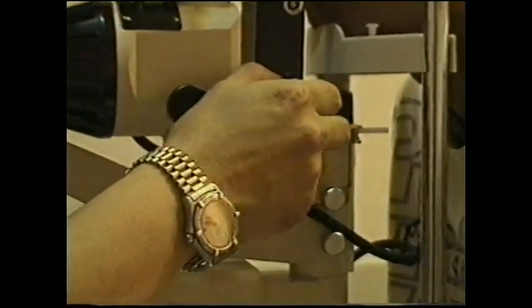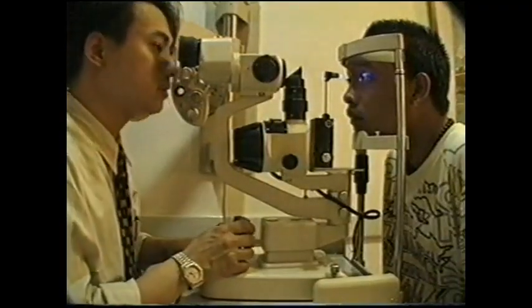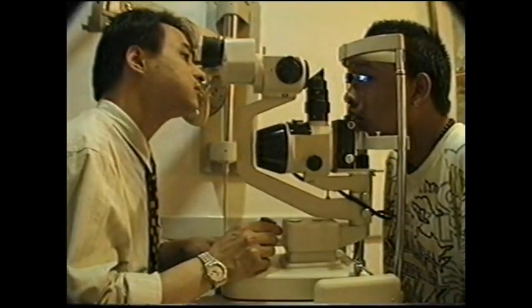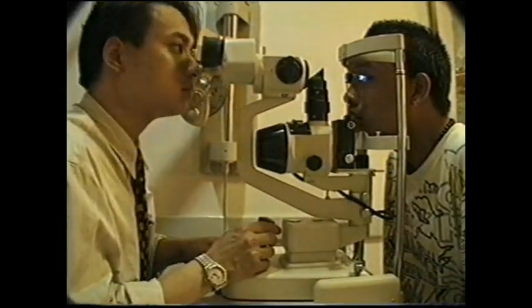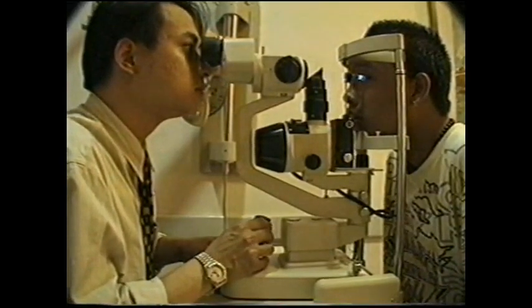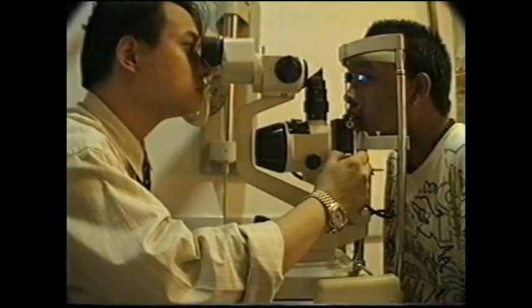Raise and lower the slit lamp biomicroscope with the control handle until the semicircles are equal in size. The semicircles can be viewed monocularly through only one of the slit lamp oculars. Slowly and gently turn the force adjustment knob in the direction required to move the semicircles until their inner edges just touch and do not overlap.